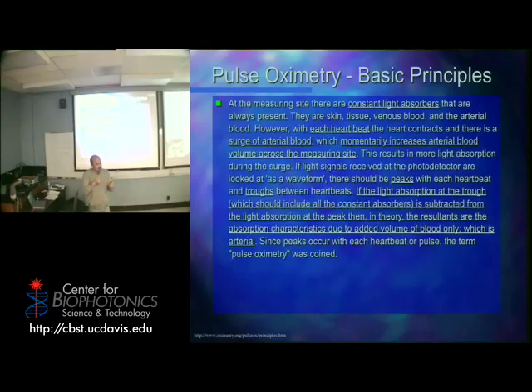You got to take some blood out, and then you use a system that you might have heard about in chemistry: partial pressures of gases. There's a machine that basically can measure the partial pressure of the CO2, the partial pressure of the O2, any kind of gases that you want to measure. It takes several minutes to get that reading.